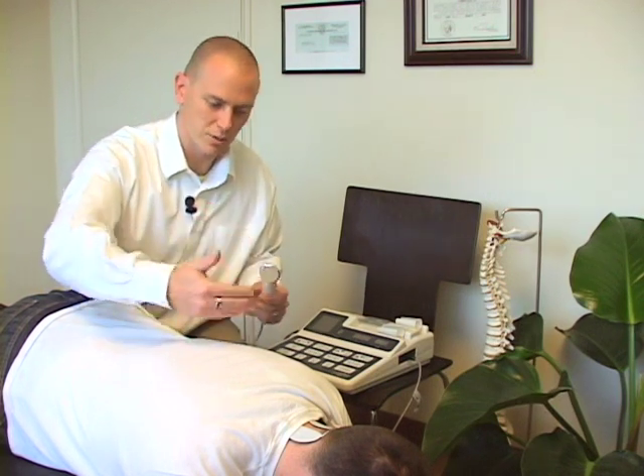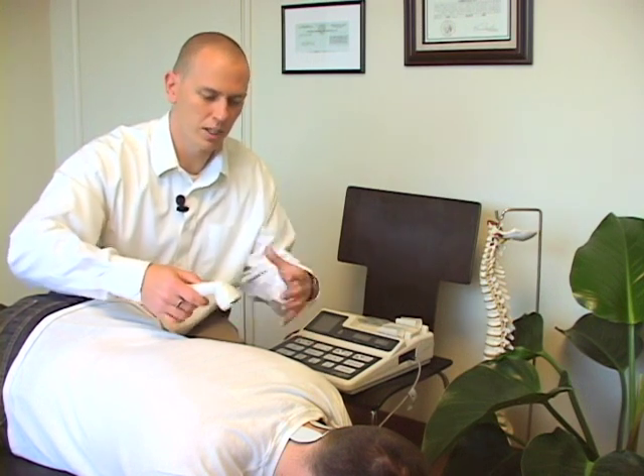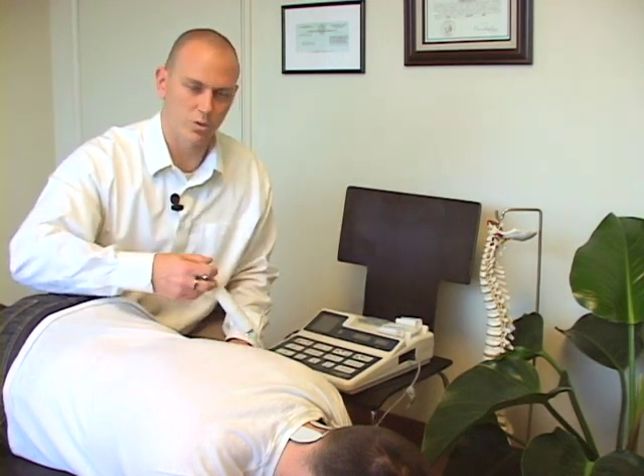The point of ultrasound is deep heating therapy, which helps reduce muscle tension in those areas. If someone is very acute, we're not going to use this because heat in acute situations don't go well together. But if someone is very chronic or subacute, we can use this to help promote further healing and muscle relaxation. It just complements the adjustment nicely.